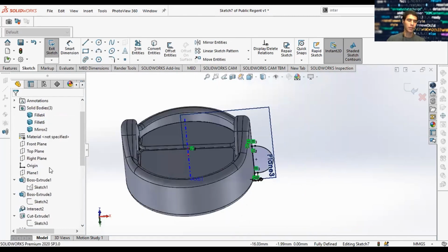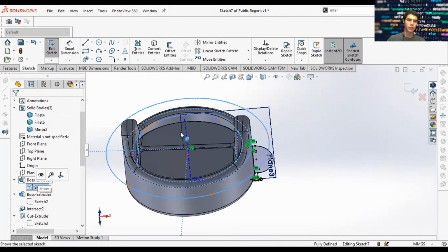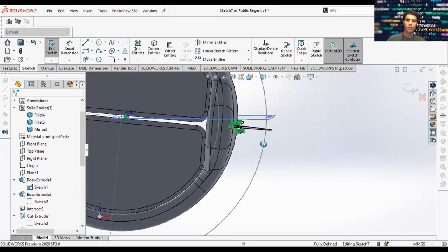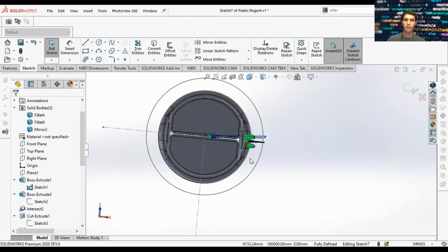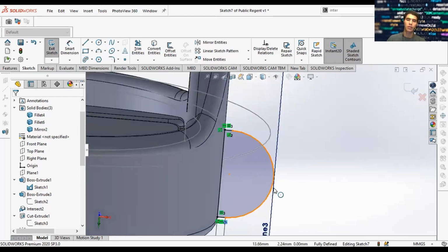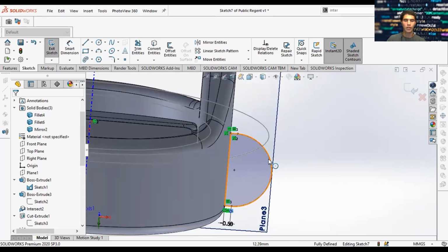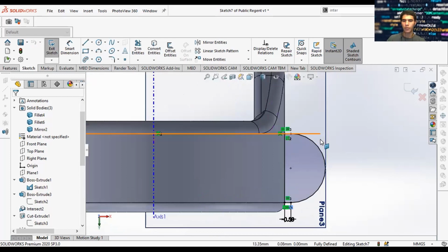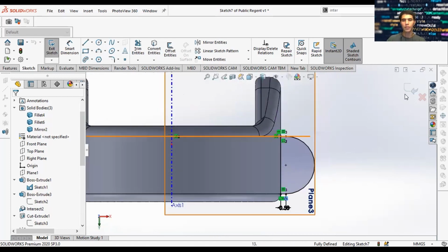Cool. Let's go back to the original sketch and just look from the top. Show. And we'll see that this outer ring that we have on our sketch would be the cuff, the cuff circumference or the cuff diameter. So we have our inner annulus, and then we have our outer cuff. We want this sketch to be touching the outer cuff. So let's go ahead. And that looks good. It's more or less along the cuff threshold right there. Just a little bit above it. That's fine. We'll do the sketch.